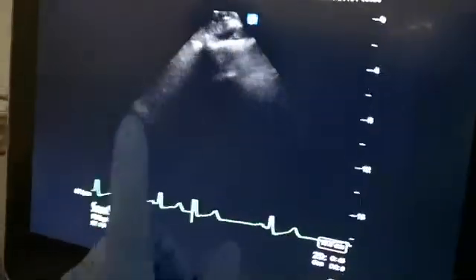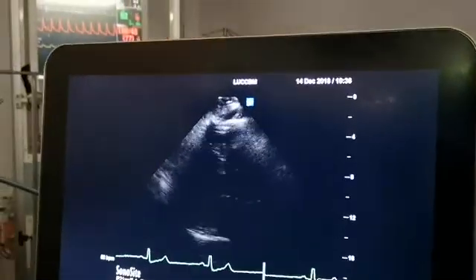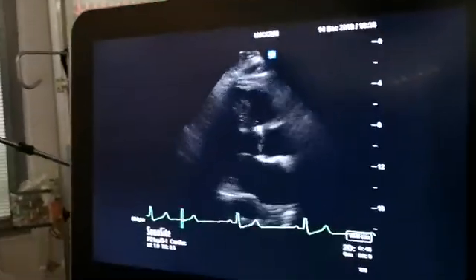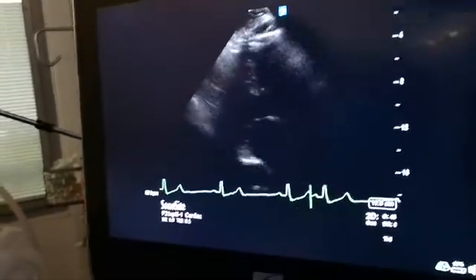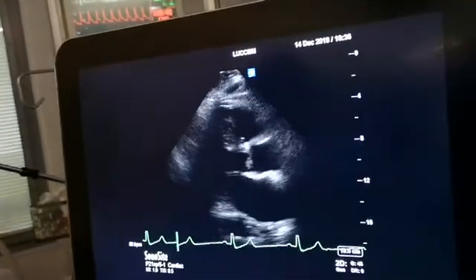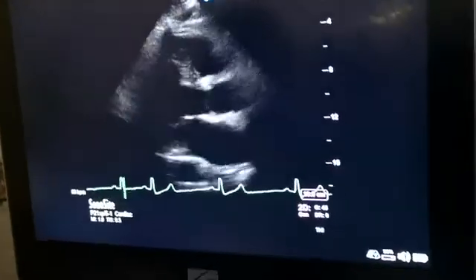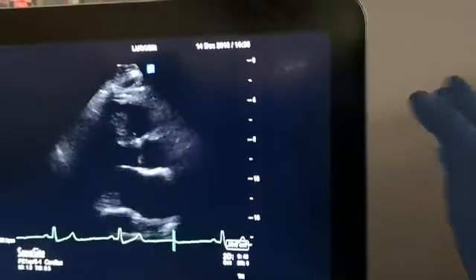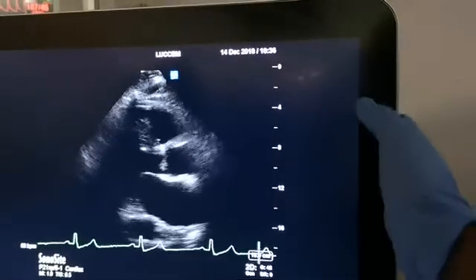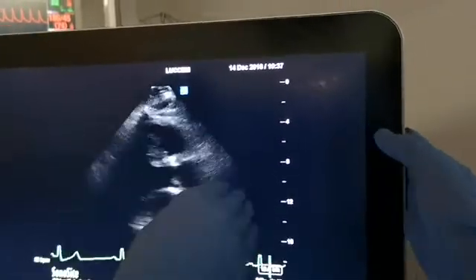The next thing is you also need to know the anatomical relationship of the screen and the probe. For the parasternal long axis, your probe is facing the right shoulder, which means this part of the screen corresponds to the right shoulder direction. This side is going to be towards the apex or the left hip. Now, does this part of the image have the heart or the lung? We've got some lung coming in.